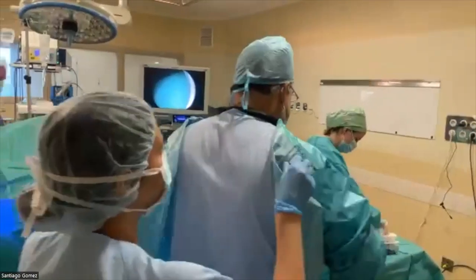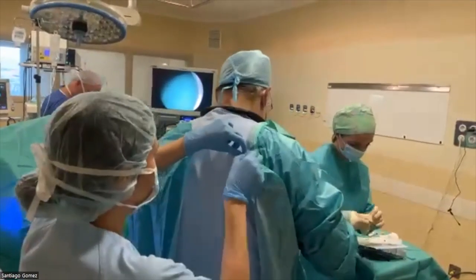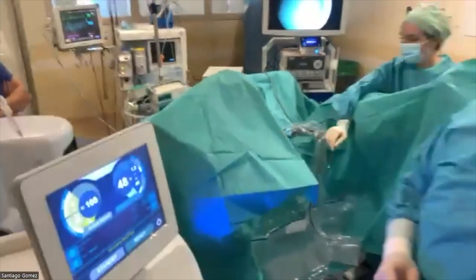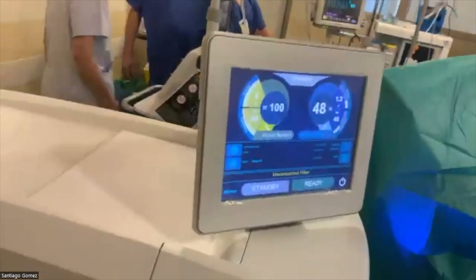We have attendees again from UK, France, Germany, Switzerland, okay, who are interested or slowly learning the HoLEP. So again, if you explain how to start for beginners, as last time. Brilliant. We will try to cover all the aspects, not only of the technique, but especially how to use the right settings of the laser, and why. Well, my settings, maybe you can show the settings.